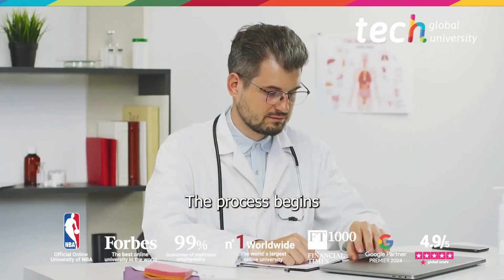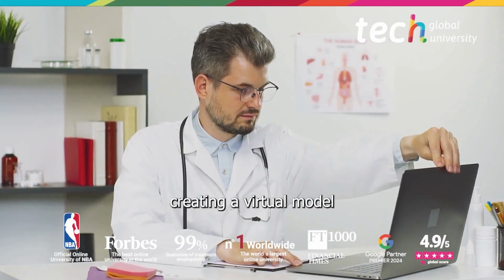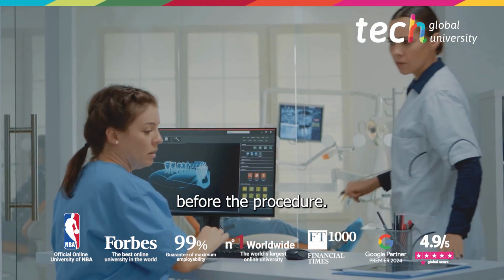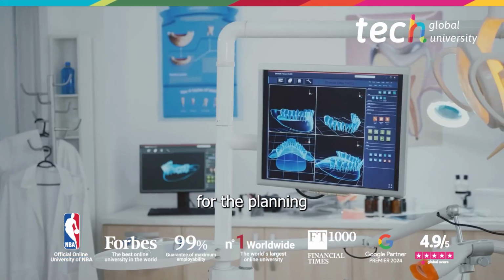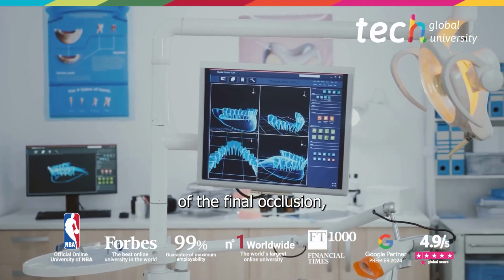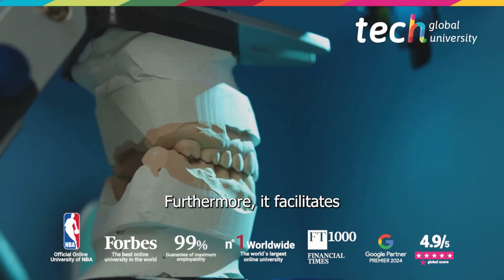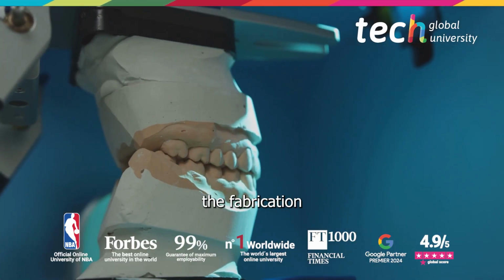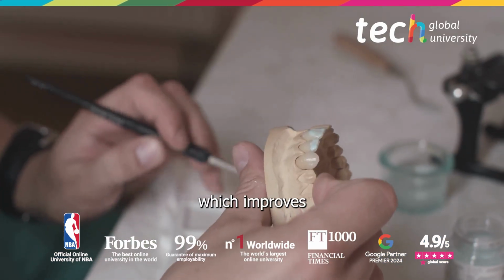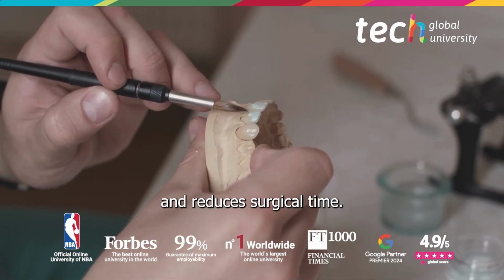The process begins with the fusion of different digital records, creating a virtual model that simulates the surgical outcome before the procedure. This simulation allows for the planning of bone movements, verification of the final occlusion, and anticipation of aesthetic changes. Furthermore, it facilitates the fabrication of surgical splints using 3D printing, which improves intraoperative precision and reduces surgical time.